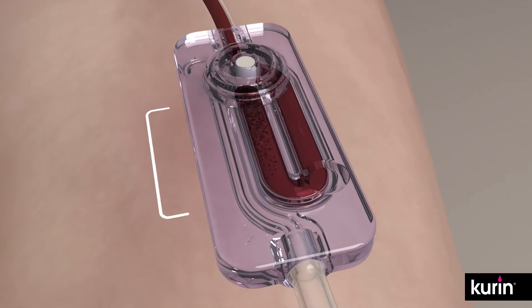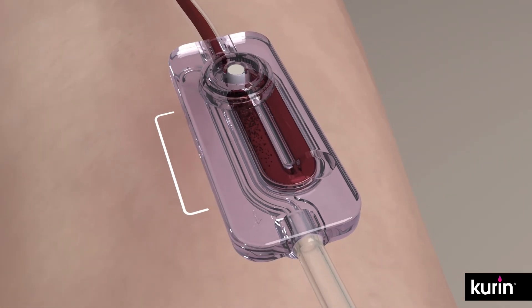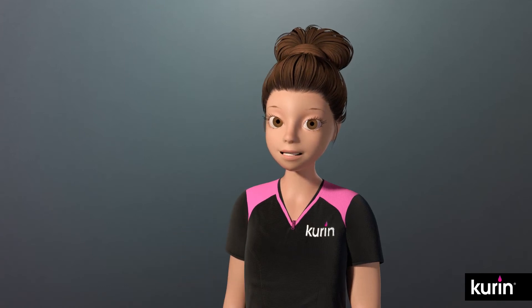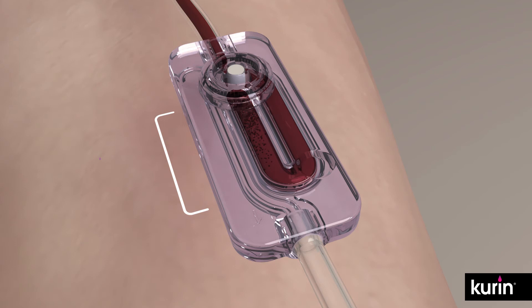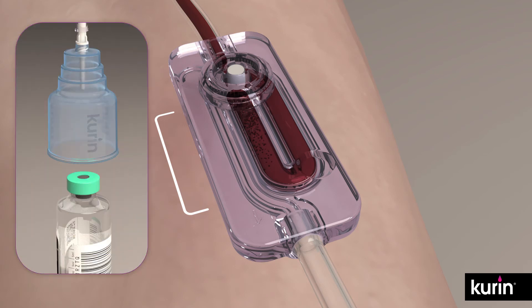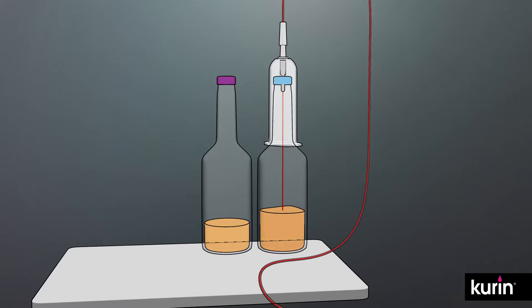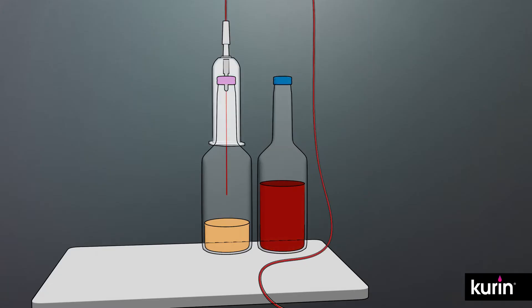This is important — always wait for the blood to stop advancing before attaching the blood culture bottle to the bottle holder. Wait for it. Now, fill the culture bottles per hospital policy. Then draw blood for additional labs if needed.